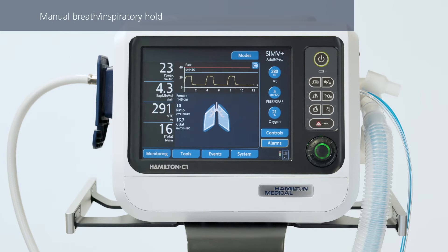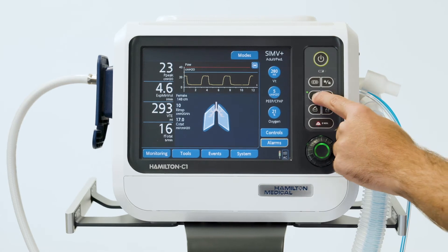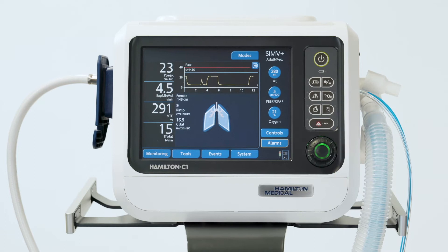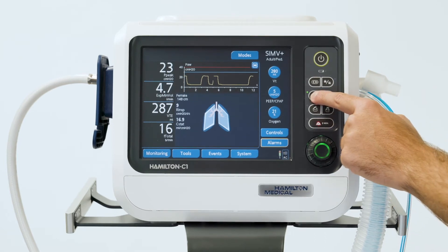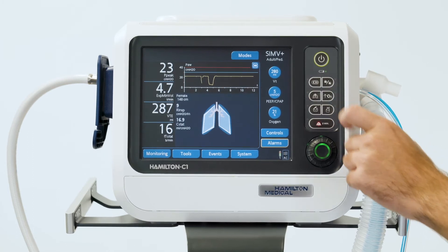If you need to perform an inspiratory hold maneuver or deliver an extra breath manually, you can use this key. To deliver a manual breath, just press and release the key during exhalation. The ventilator will use the mandatory breath settings. To perform an inspiratory hold, press and hold down the key during any breath phase. The device maintains the inspiration pressure until you release the key, or for a maximum of 15 seconds.